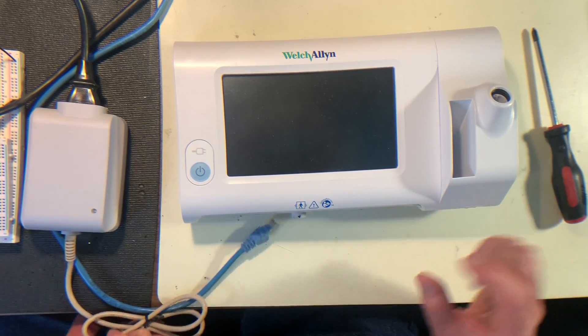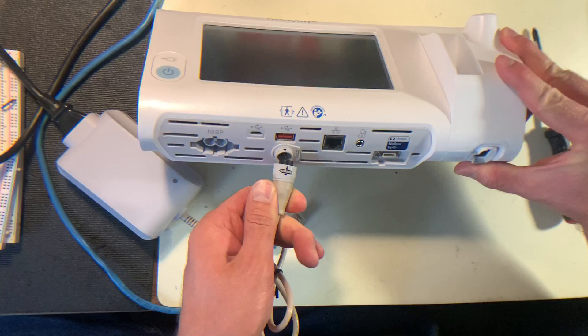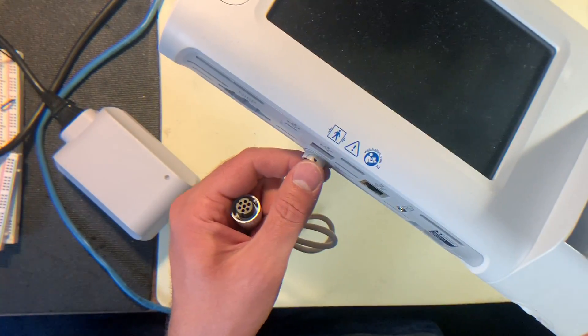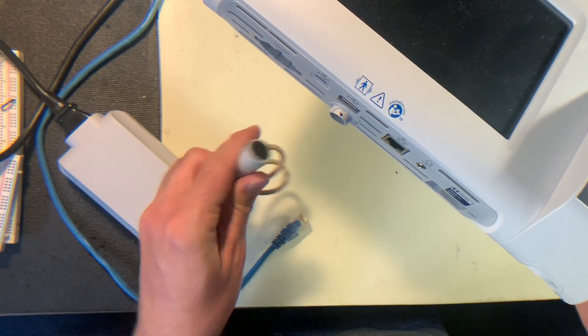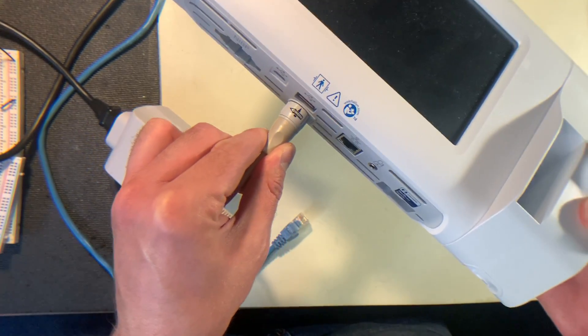To power the device on, really all that you need is just the power cable. You just put it in and match up the arrows — you can see the arrow on the top of this power port here. Just match it up with the arrow on top of this plug and it'll snap in.